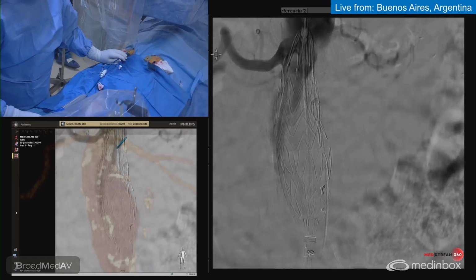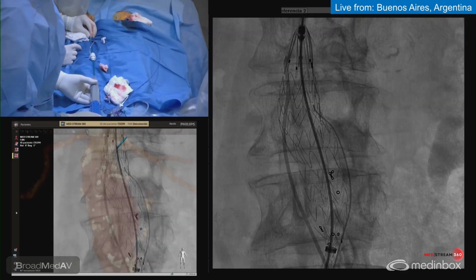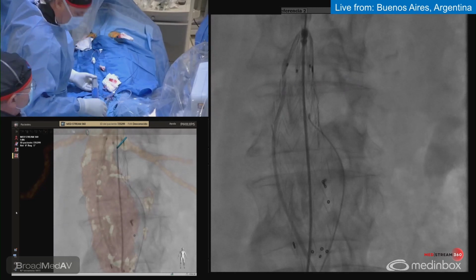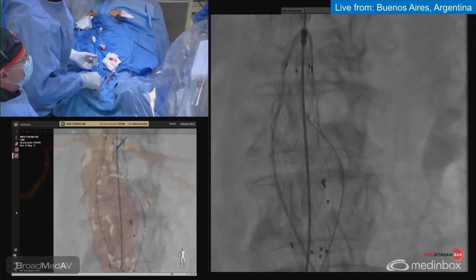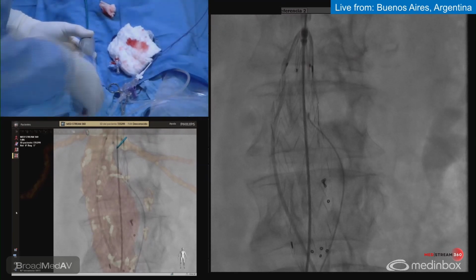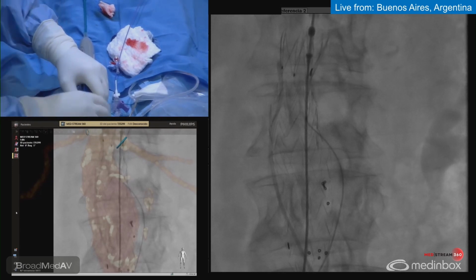Okay. So left renal artery is okay. So the situation is okay. And now the contralateral stump is okay. Okay, Gustavo? Don't push, eh? Okay. Release it. And now, oh, it's okay. Now you are going to release the free flow. Yeah. I have to rotate this blue one, unfortunately, here, holding the device. Yeah, now it's released. Perfect.